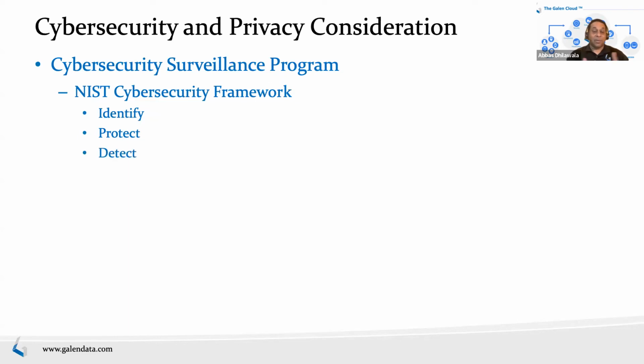First, if a cybersecurity event happens, you need to be able to detect it, and detect it fast. So how do you do that? How do you put in tools and processes for that? You have to think through how you will do that. Would you be monitoring logs? If you have an audit log, are you monitoring what functions are being done? Are any privileged functions being done at the wrong time?